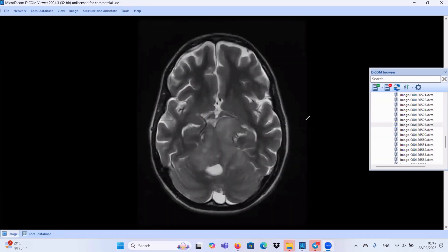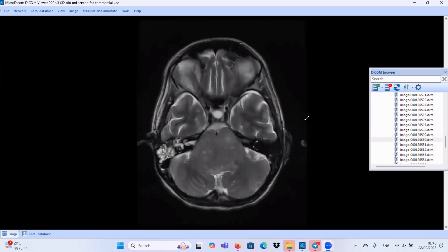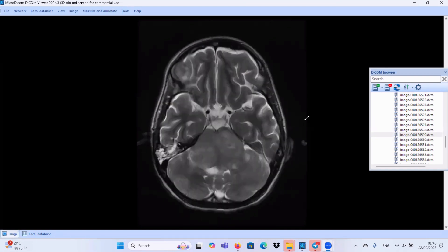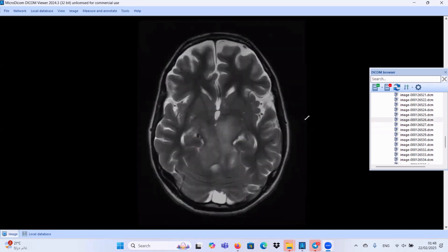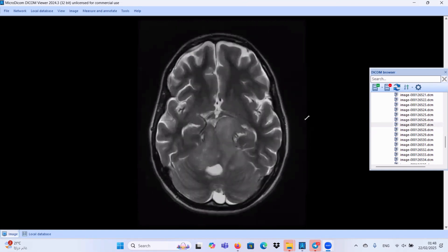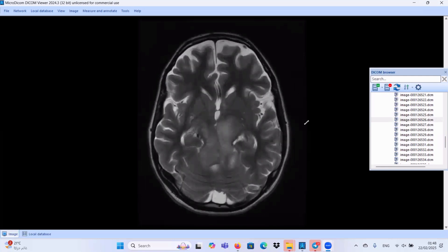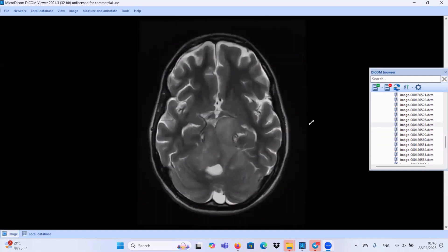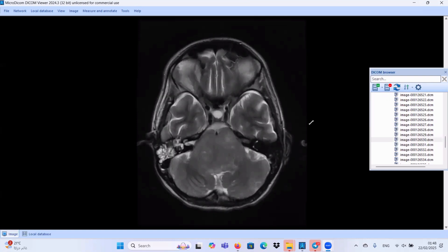We did an MRI scan for the same patient. As you see here, the pons is markedly swollen by a mass lesion — a space-occupying lesion. The space-occupying lesion extends along the middle cerebellar peduncles, and also extends superiorly along the two cerebral peduncles of the midbrain. This is very characteristic for diffuse pontine glioma. That's enough for today, and thank you so much.